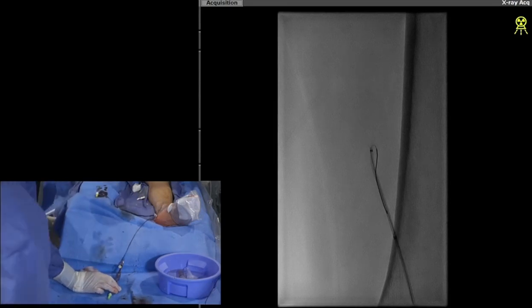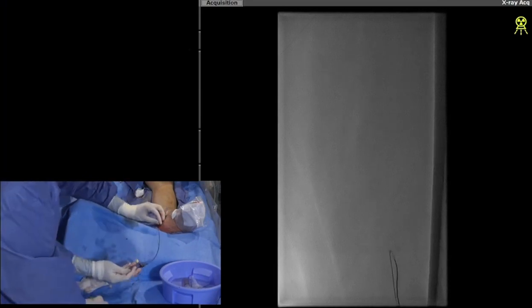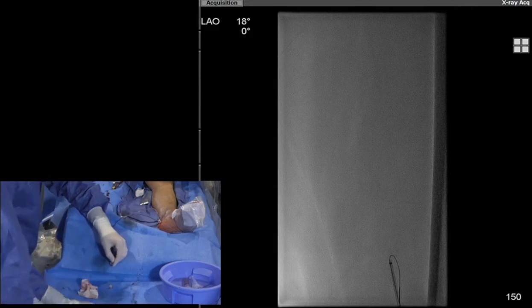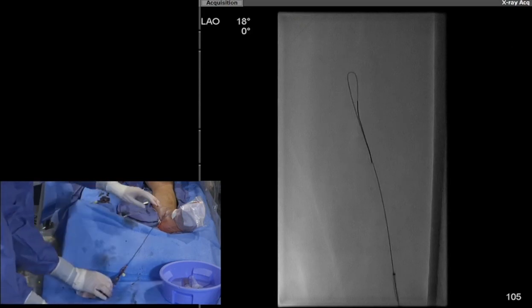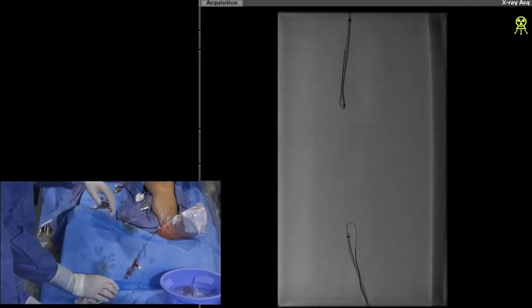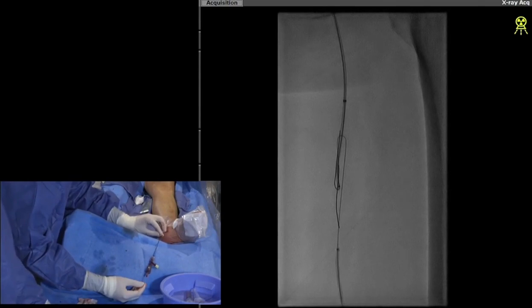I'm supporting my 018 wire with my Navicross catheter. You're starting with a loop — I never start with a loop. I always start with a straight CTO wire on a 014 platform, because with an 035 platform loop there's a possibility you could go out and ruin your chances of crossing. A great point, but it depends on how the wire and catheter are behaving. We're not meeting a lot of resistance, which is good. However, looping the wire going into the SFA may take you into the common femoral.